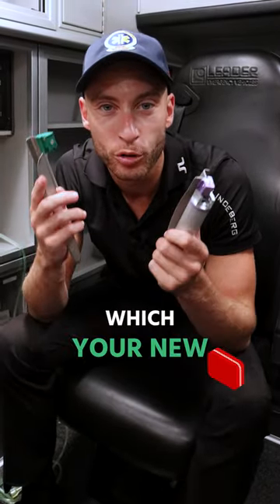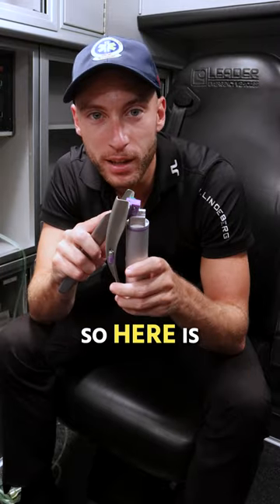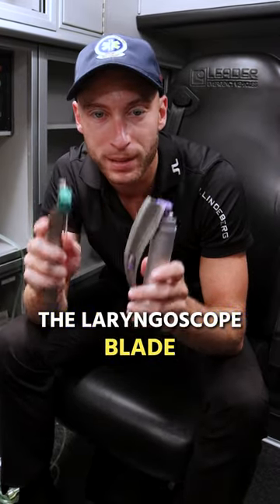Welcome to day one of medic class. I got to show you something with your new equipment. So here is the laryngoscope blade.